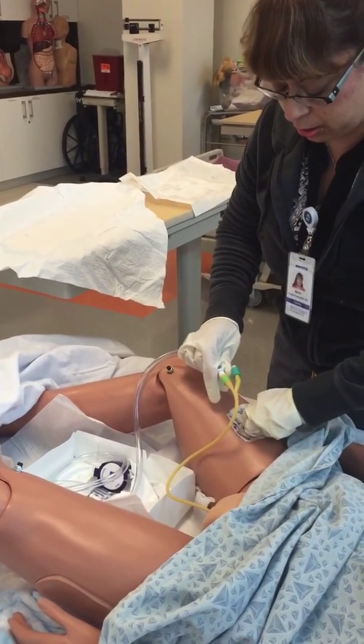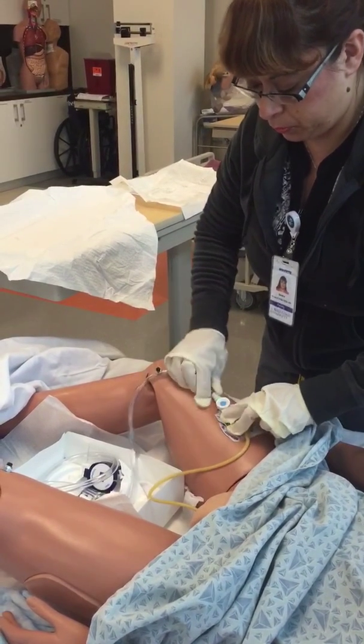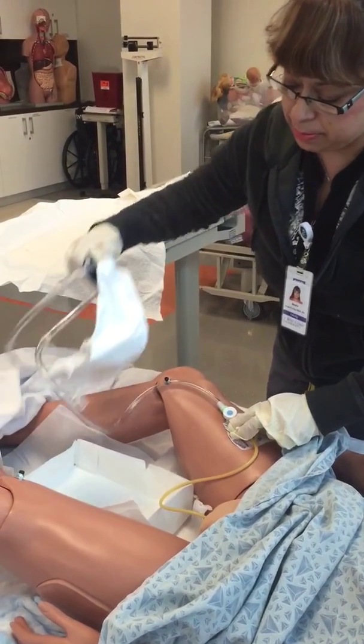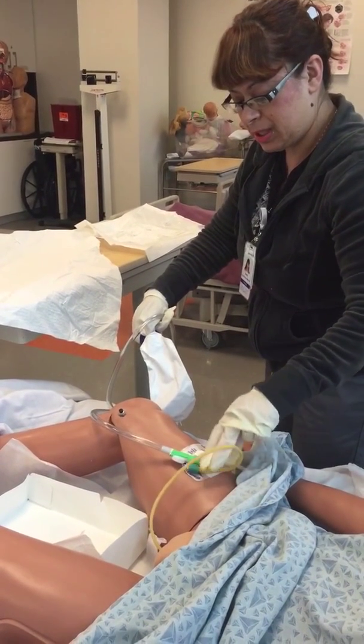Attach here to the leg area. Not working here. And attach this bag to a non-movable part of the bed. Let's say it stayed there.